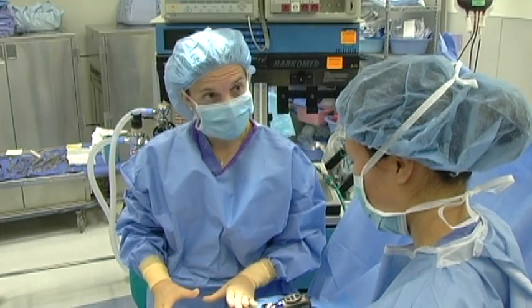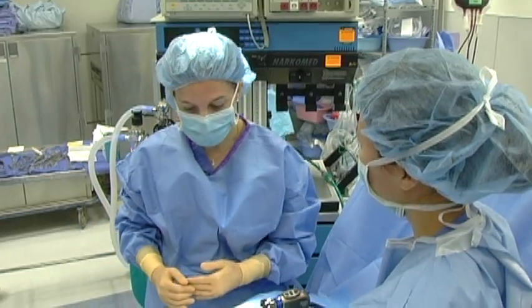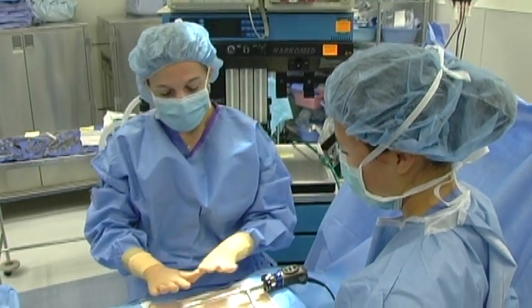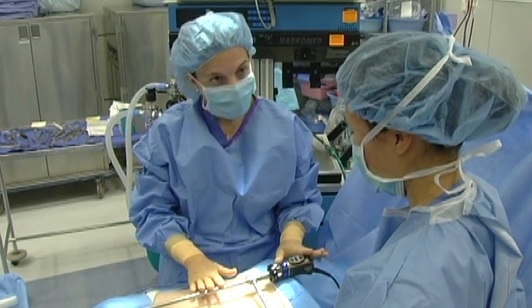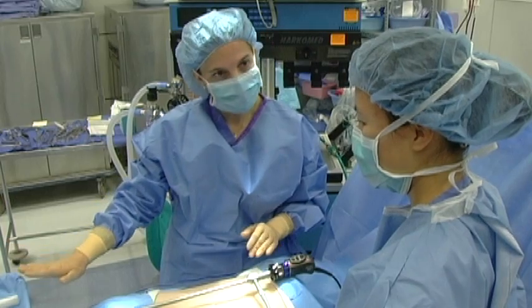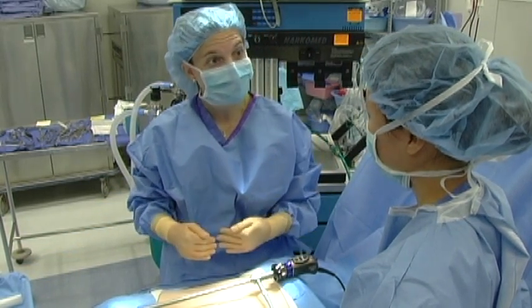First we're going to start with how to put the trocars in. For a laparoscopic hysterectomy, I use four trocars — some use three. We're going to assume we have pneumoperitoneum already and we have our camera ready. A bipolar is also available to us, so if we start this procedure and have a complication, we're ready to address it.